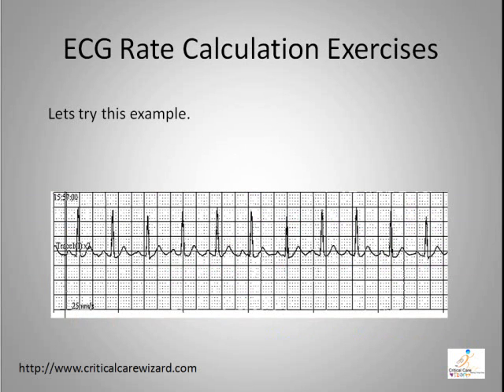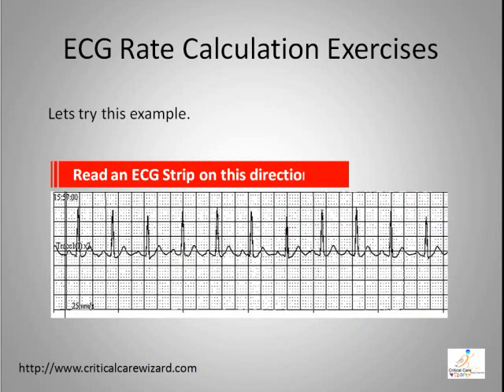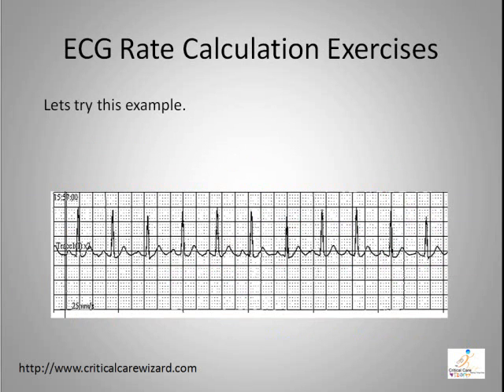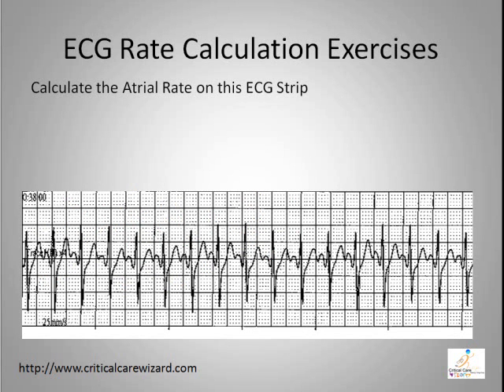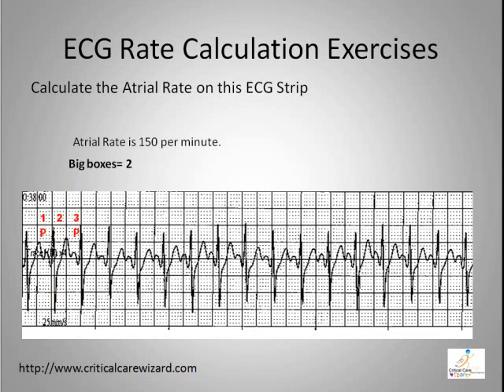Let's try a real-world example. It is recommended that you always orient yourself to the leftmost of the ECG strip, then work yourself to the right. Next, identify the similar waveforms — look for a P-wave to represent your atrial rate and an R-wave for your ventricular rate. To calculate the atrial rate on this ECG strip, identify the first P-wave to the immediate next P-wave and mark it. The distance between P-waves is two big boxes, so the atrial rate is about 150 per minute.